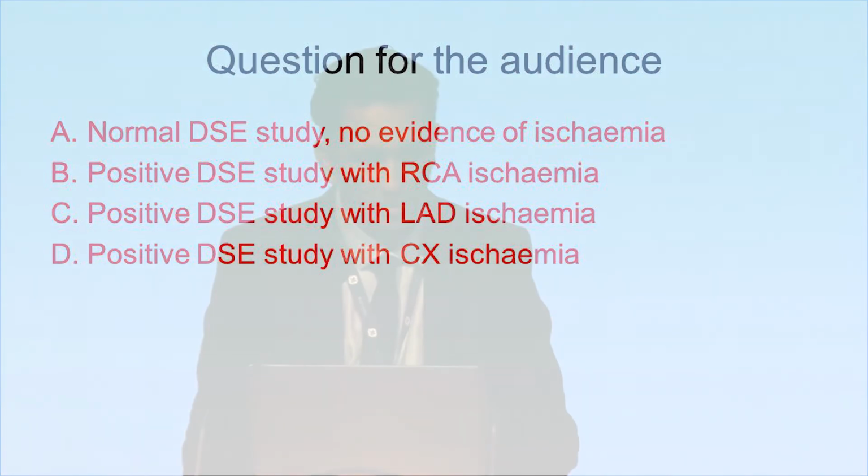So patient goes on to the question. So is this a normal DSE study, positive DSE study with RCA disease, LAD ischemia, or circumflex ischemia? Yeah, I think clearly we can see the apex was going, so LAD disease there.